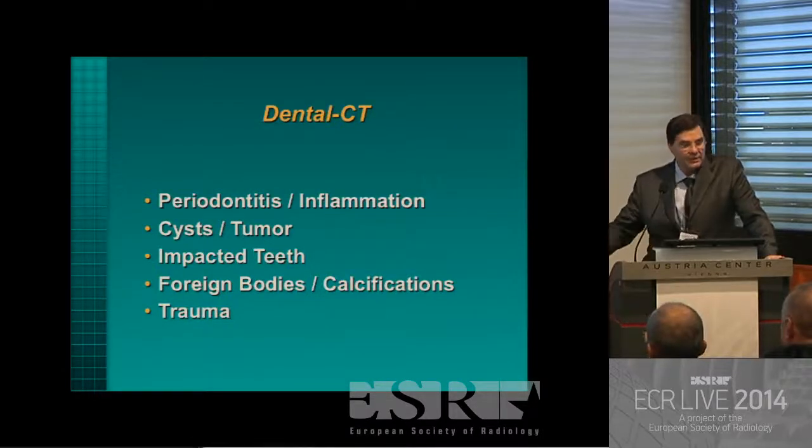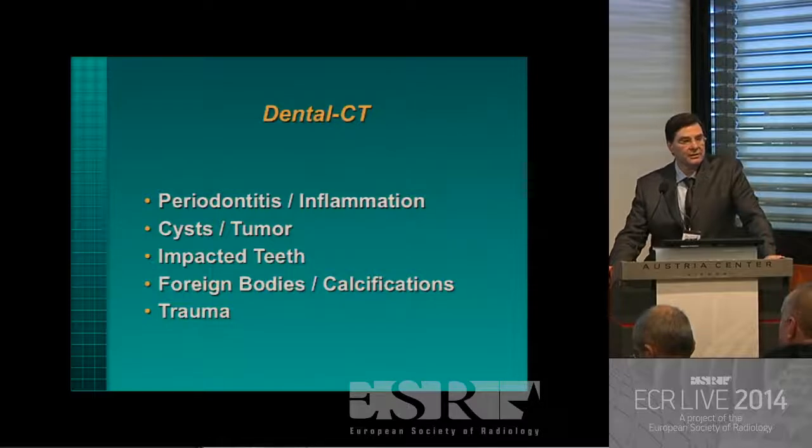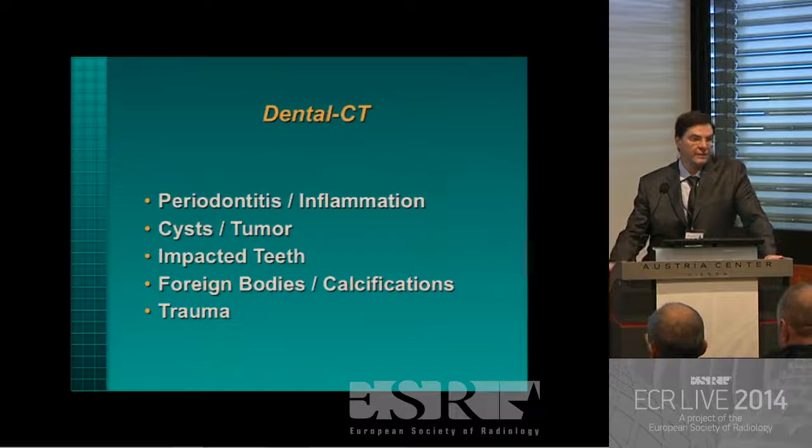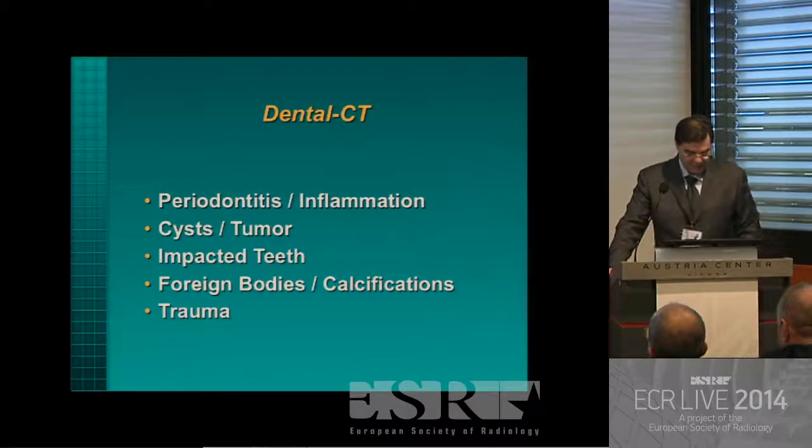Implantology we've seen. That is the part which we do on a daily basis. Meanwhile, imaging of pathologic processes with dental CT is about 2/3 of all indications. So any kind of pathologic process is more frequent than performing implantology.